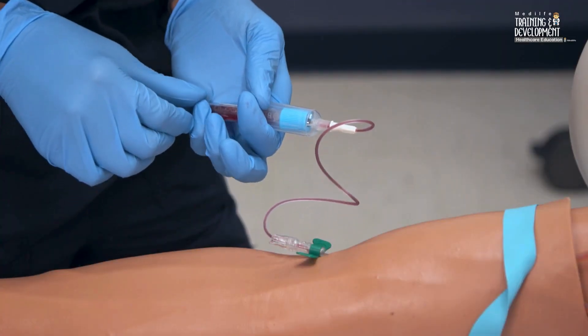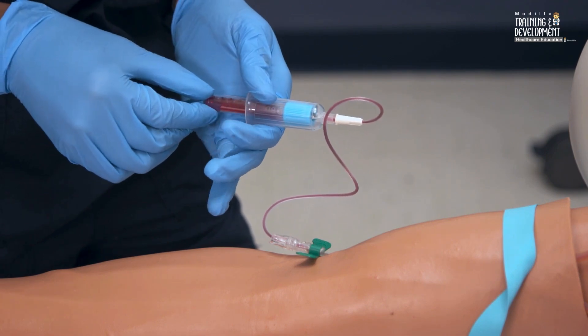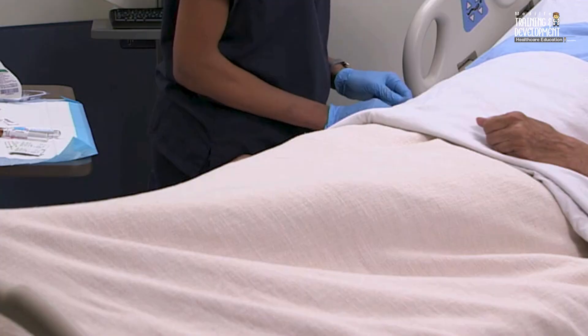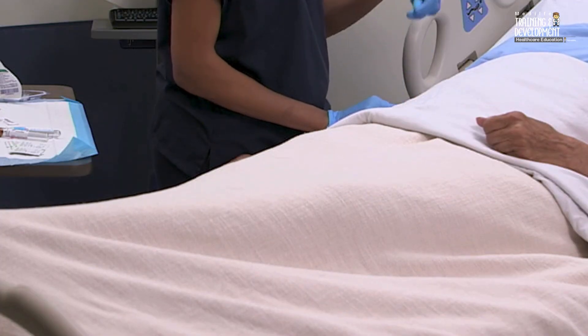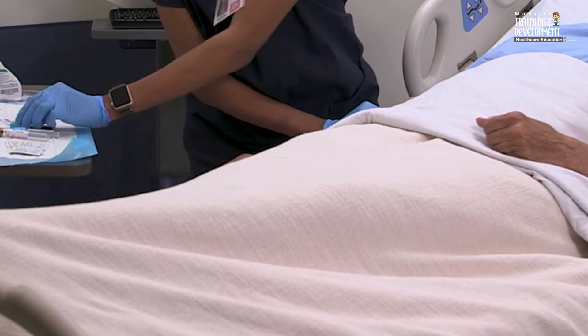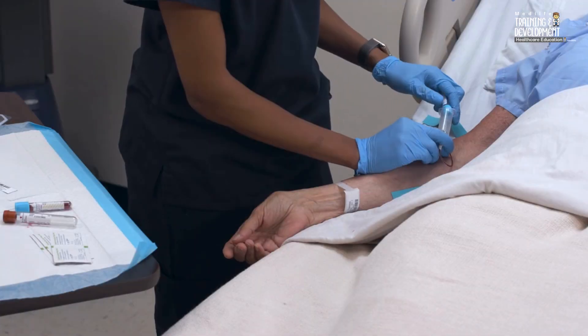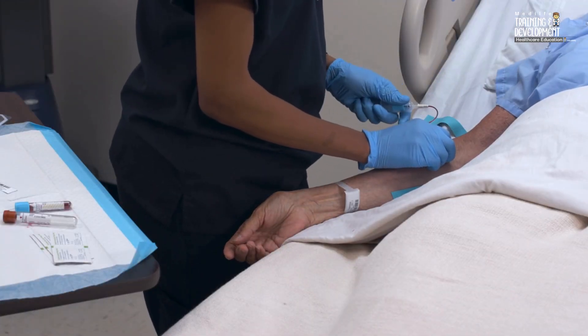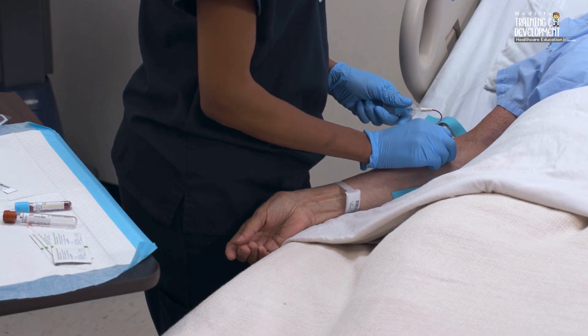When the first tube fills to its correct volume and blood flow ceases, remove the tube from the holder. Continue to fill the required tubes using the correct order of draw, removing one and inserting another. Gently invert each tube and then return it to an upright position as you remove it to help mix the additive with the sample. Doing so counts as one complete inversion for each tube.